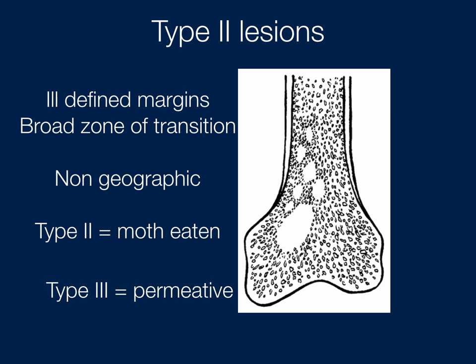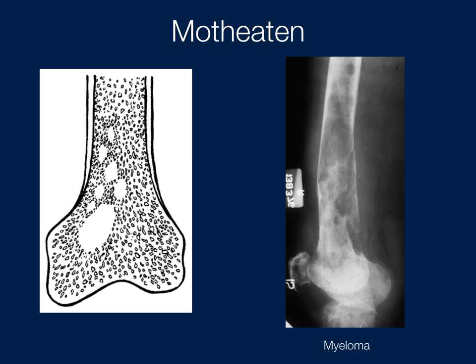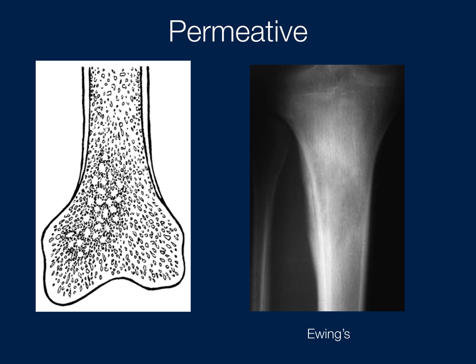The final category is the permeative — the most aggressive. It's an ill-defined lesion where it's hard to see where the tumor begins and ends, with a very wide zone of transition. An example of the moth-eaten appearance is multiple myeloma, and a permeative lesion example is Ewing's sarcoma — very ill-defined and aggressive.